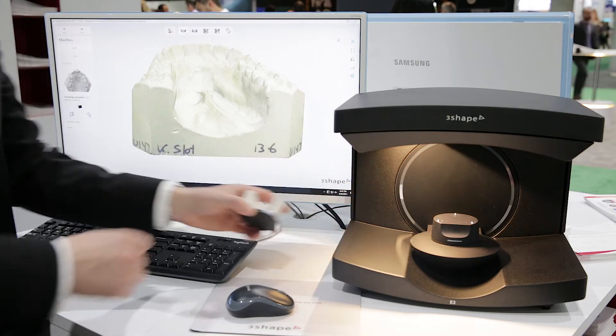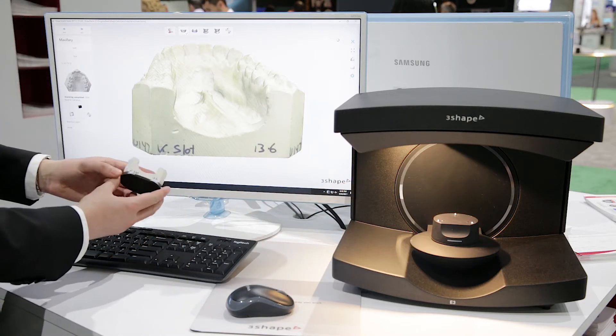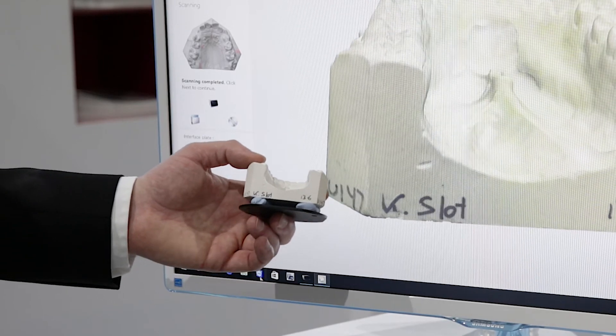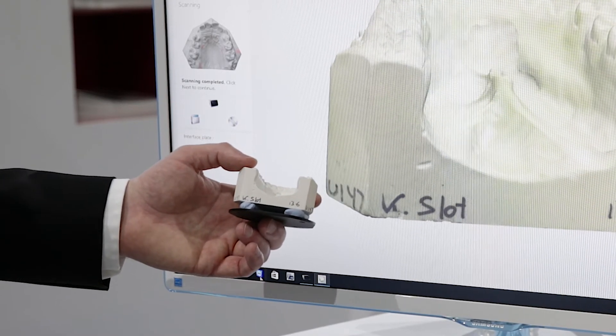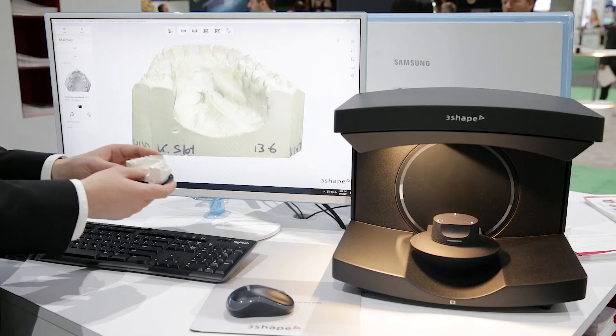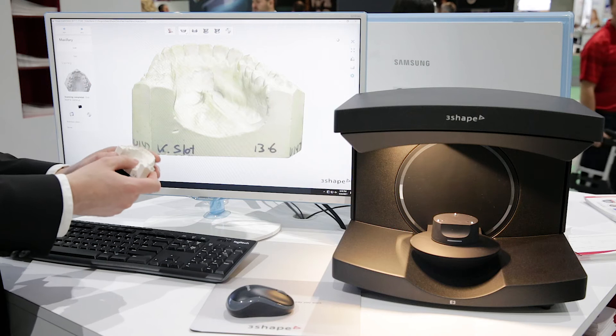Now it's done and you can see here on the screen that it has actually captured the name that is put onto this model set — but that might as well have been some annotations on where maybe you wanted some Herbst bands or other help to the lab technician who are doing the actual appliance.